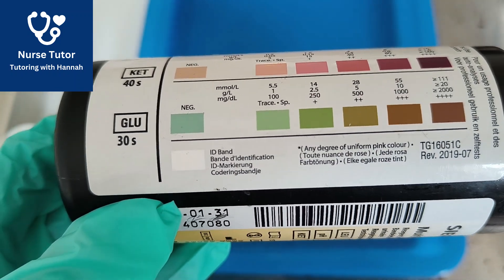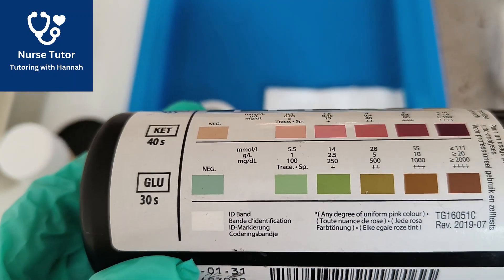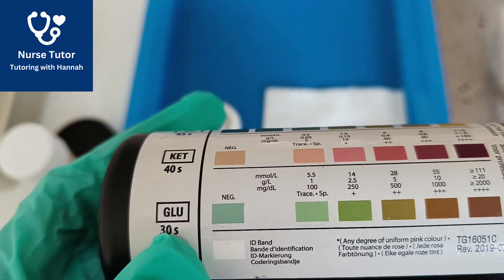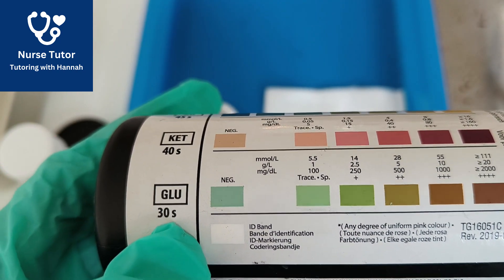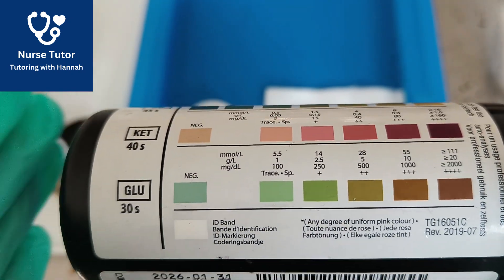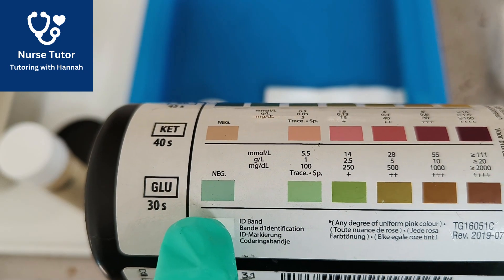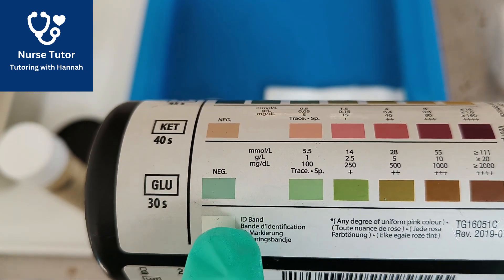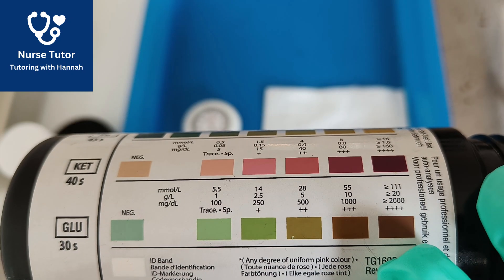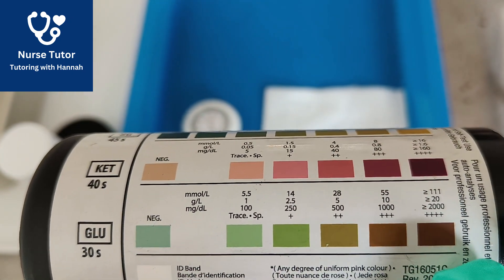Before I dip the urine, I want to show you the urinalysis pot up close. On the left-hand side you can see what we are going to be measuring, and underneath is the time in seconds — we have to wait for that time to pass before we can read the results. We then check the colour strip to see if it's changed colour. If there's no glucose, it's going to be negative and stay blue, and then it gets darker brown the more glucose is present. We have to wait 30 seconds before we can read glucose.